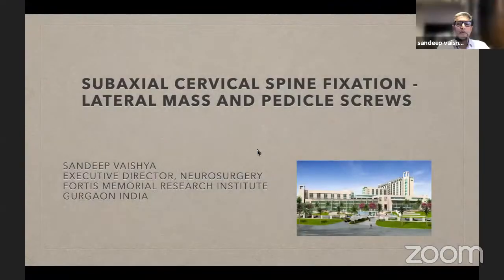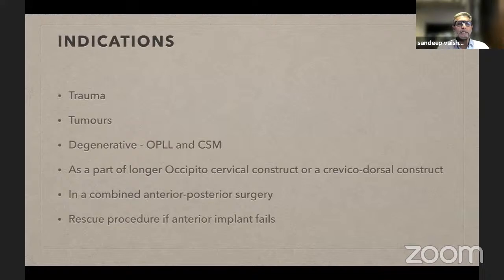So I'll talk about the subaxial cervical spine fixation, both lateral mass and pedicle screw fixation. The typical indications would be trauma, tumors, and degenerative conditions, both OPLL and cervical spondylotic myelopathy. Sometimes it is part of a longer occipito-cervical or cervicodorsal construct. Many times it is used in a combined anterior-posterior surgery, and sometimes in a rescue procedure if the anterior implant fails.